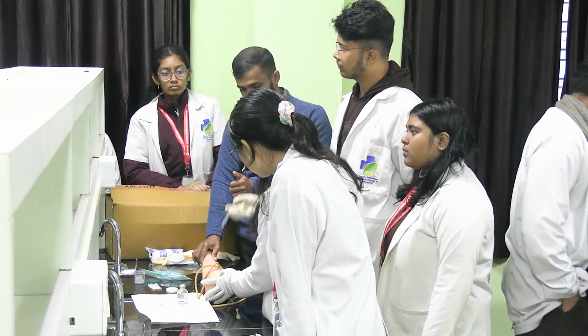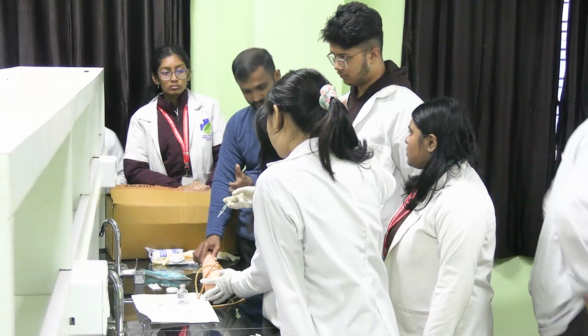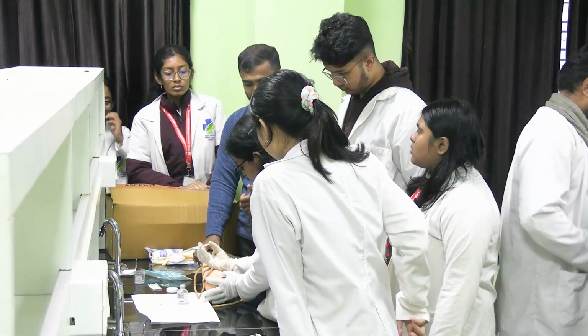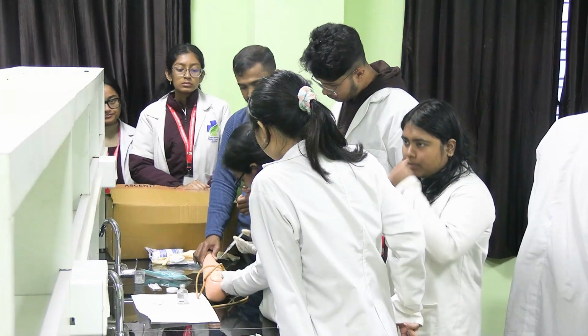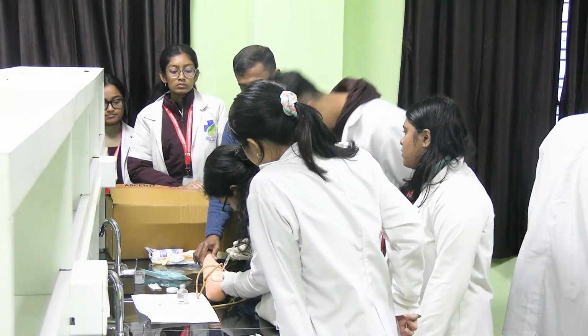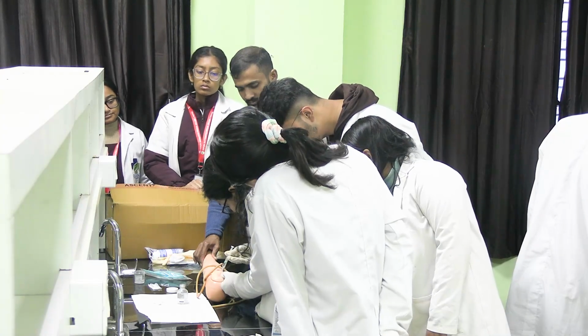I'll insert at a 90-degree angle. But what does the Z-track technique mean? Pull the skin laterally. Then inject the needle there. Introduce it into the muscle. Go a bit more.